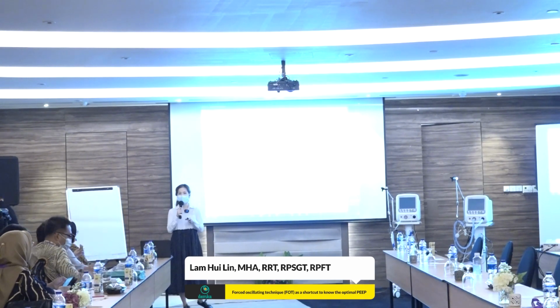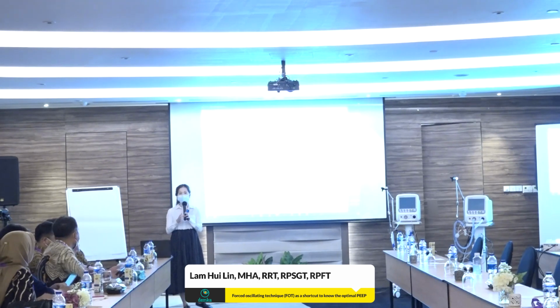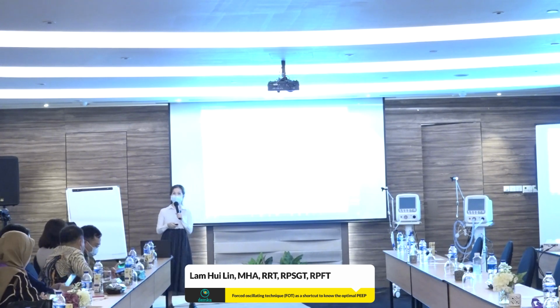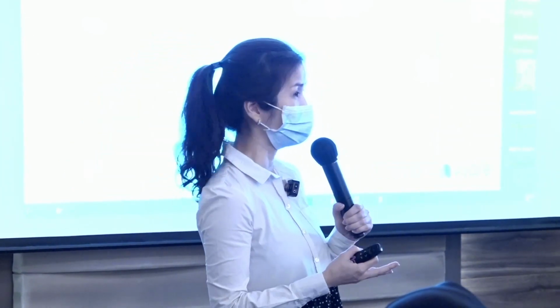Yeah, so today I will be talking about FOT, so forced oscillation technique. This is something that is non-invasive that can help you to assess your lung mechanics at bedside. Today we'll talk about what FOT is, the basic theory and principles, how we use FOT on the Fabian ventilator, and then bedside applications, as well as clinical examples.